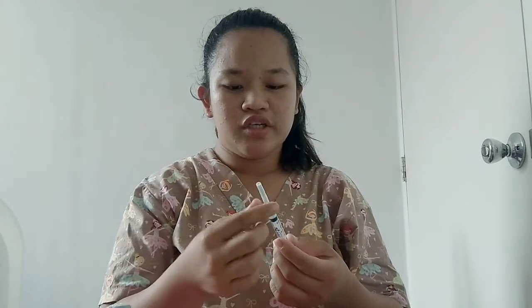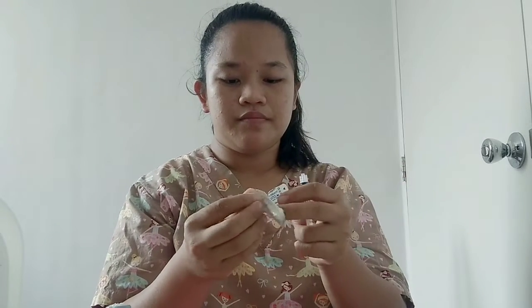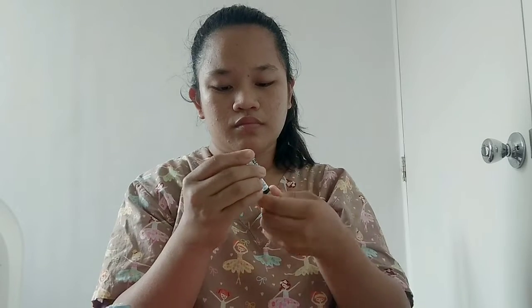Then, change the connected needle of the syringe into an aspirating needle. Make sure that it will not be loose. Then we are going to open and clean the rubber surface of the medication vial.